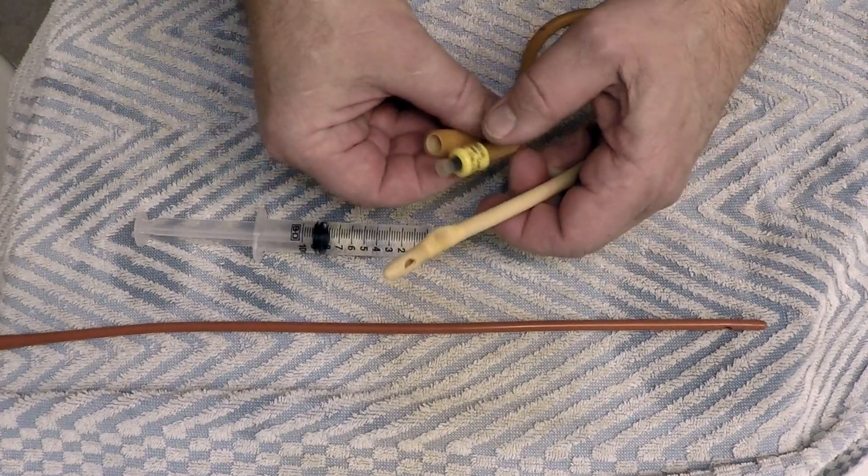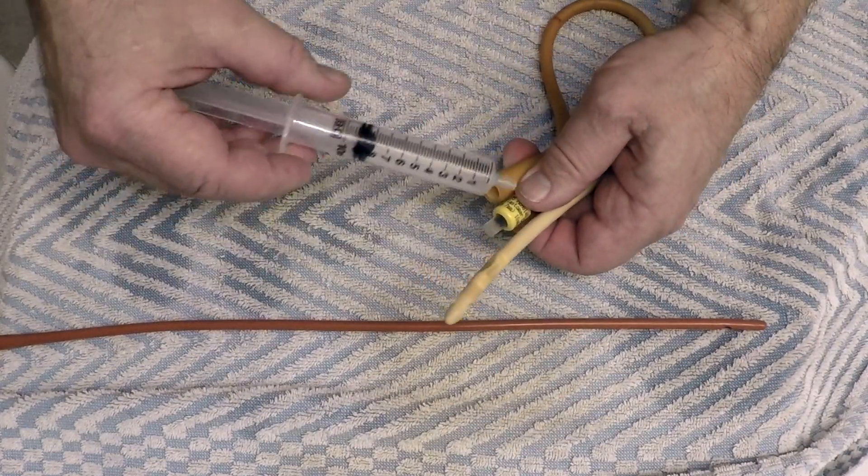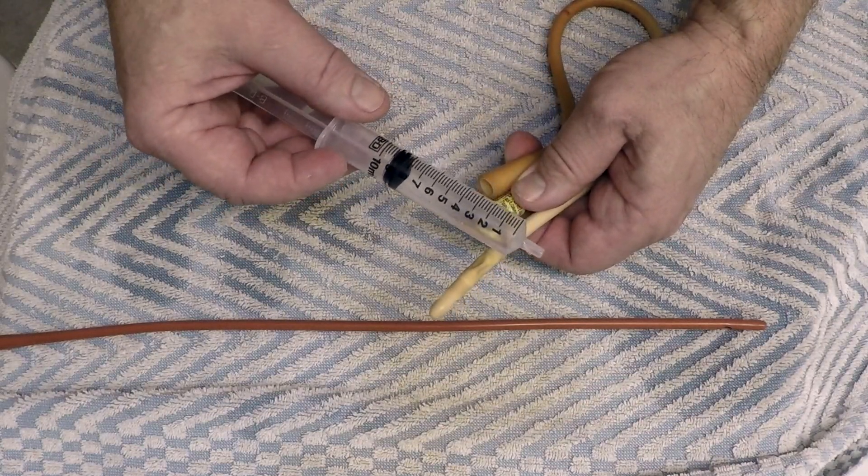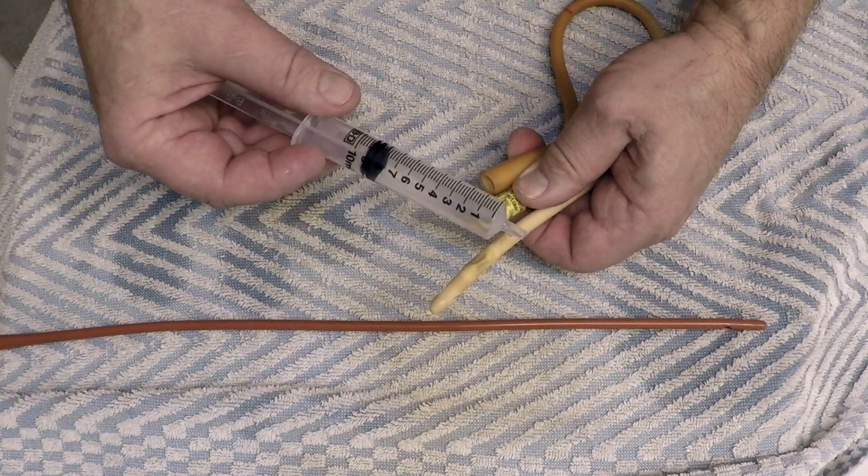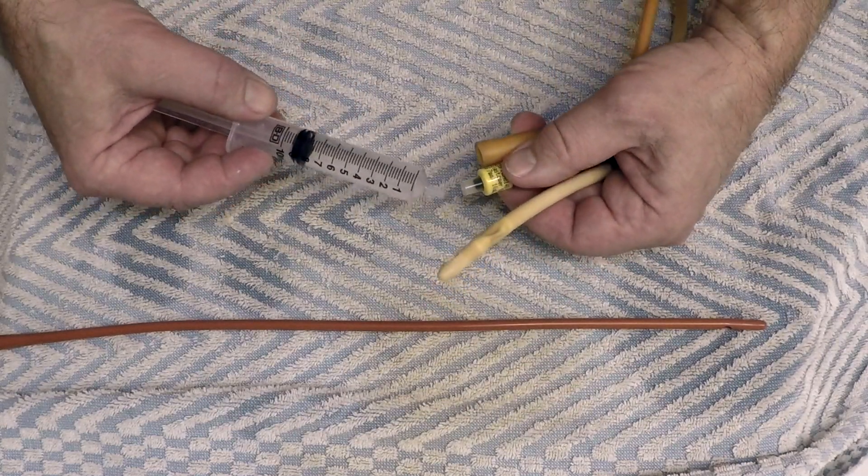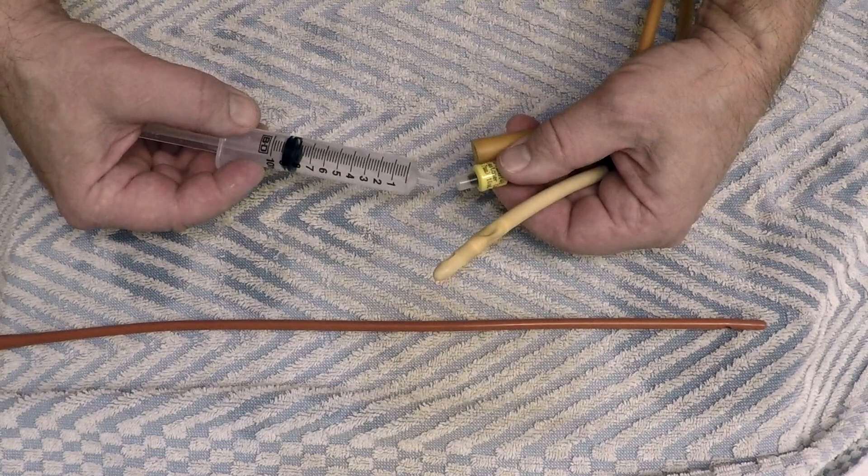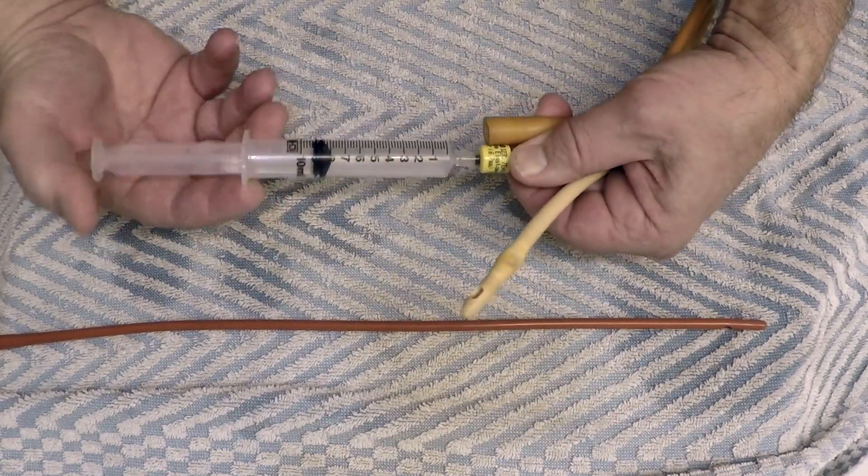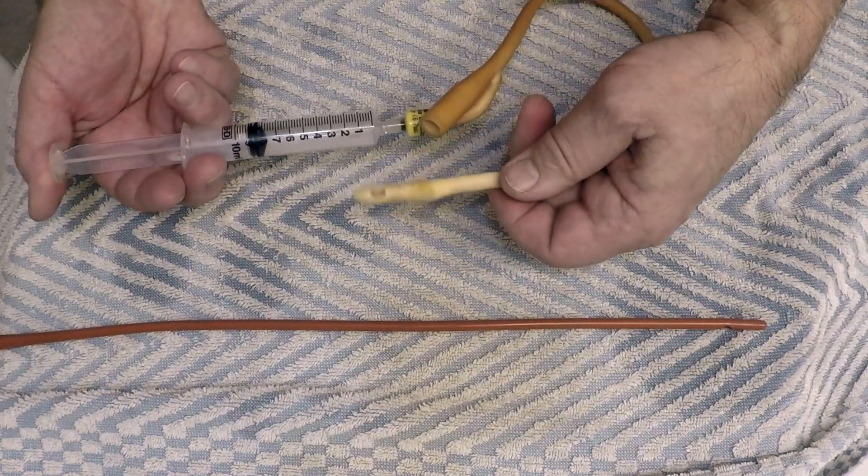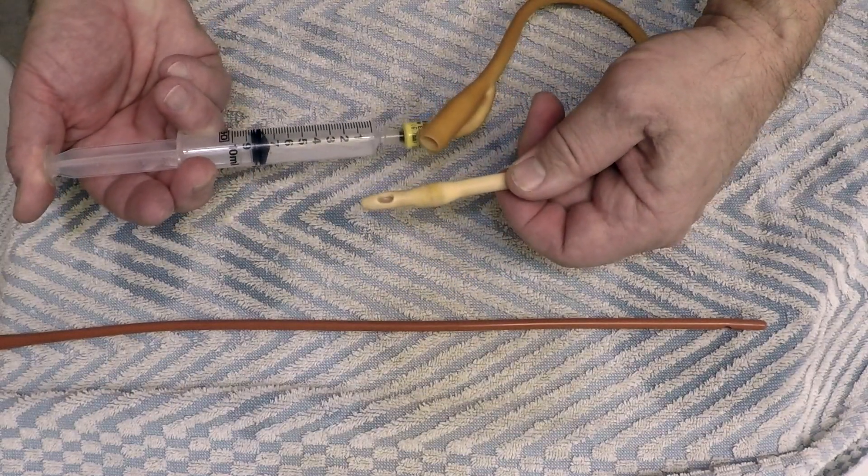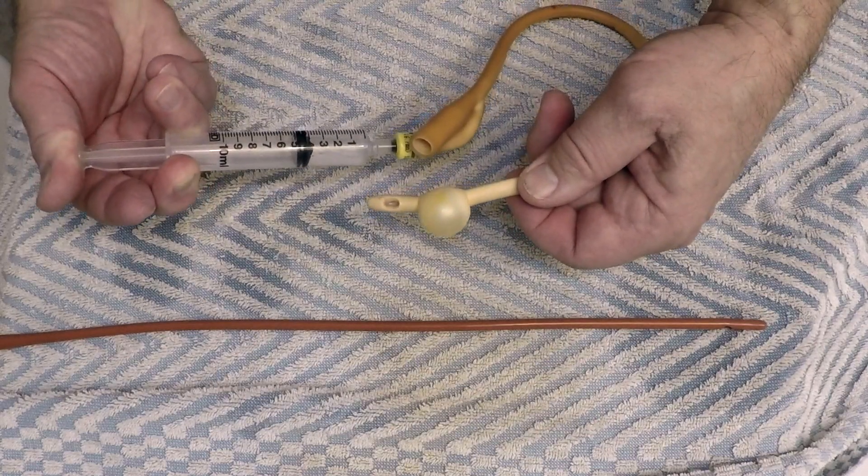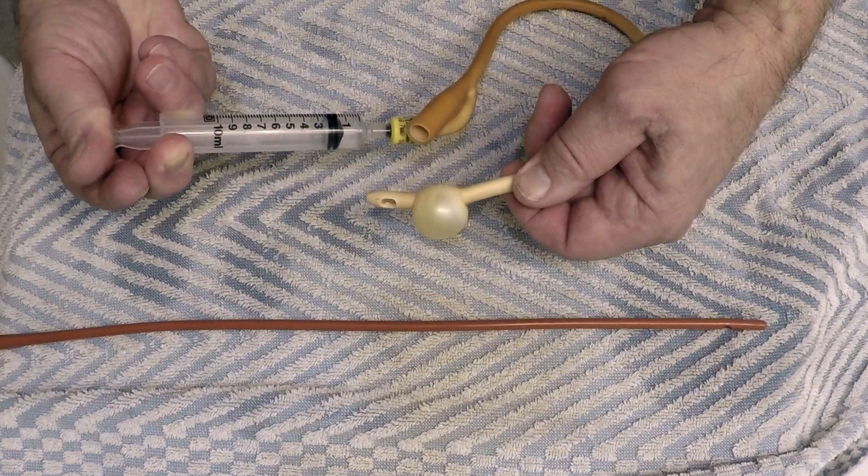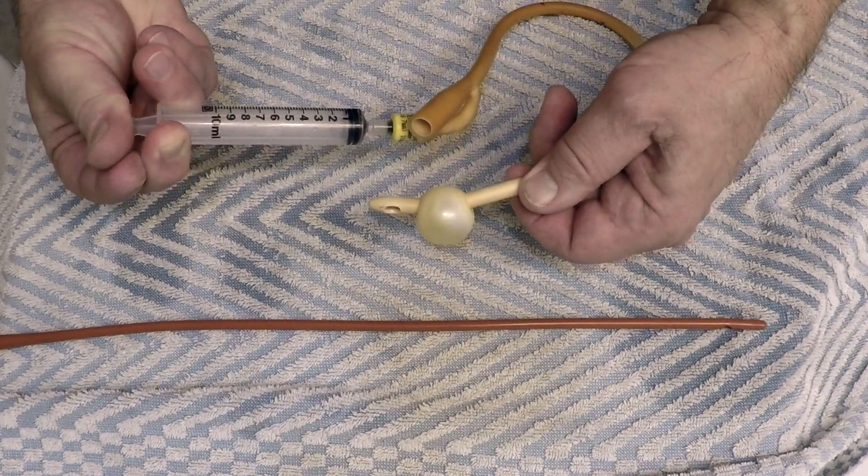So what I'm going to do is reinflate this. Here's the syringe with about 8.5 milliliters of liquid that I removed in order to remove the Foley catheter. I'll just put this back in and we'll see how big this gets.